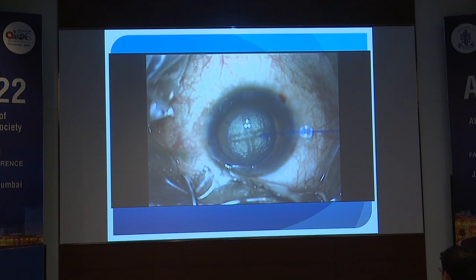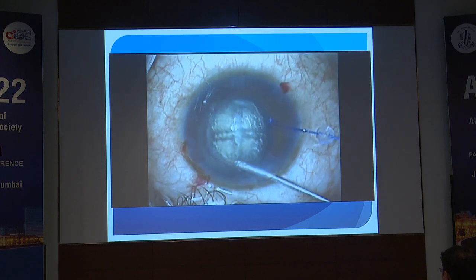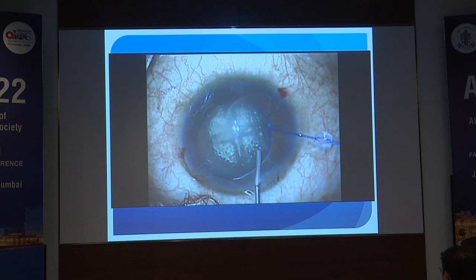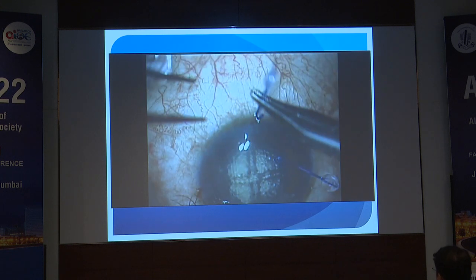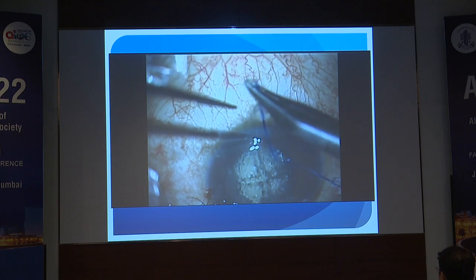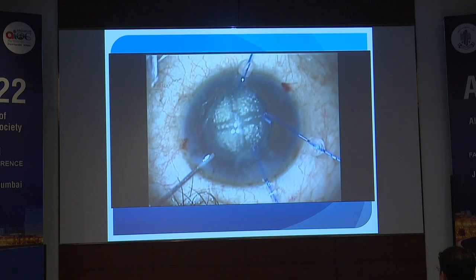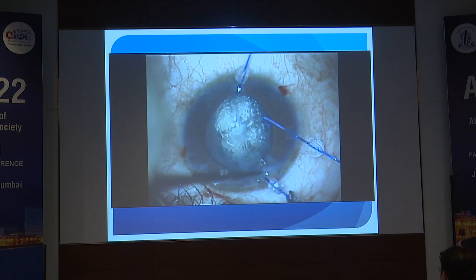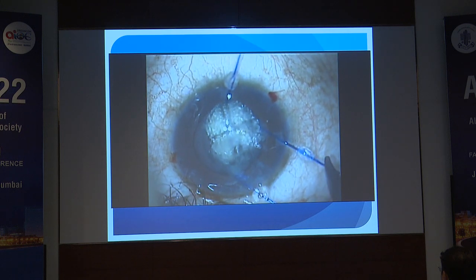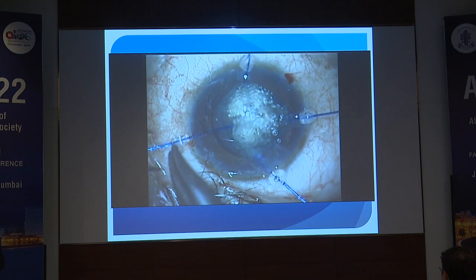Having done that, the next step is you've already done your rhexis. So that's not really a problem. Having done the rhexis, you just separate the rhexis a little off. Notice the rhexis floating free. And then use your hooks to anchor them on. Because it's a loose bag, using capsular hooks literally pushes the bag to one side. So I prefer to usually, in these sort of cases, to use just regular hooks. So we put 4 hooks and that stabilizes the bag.